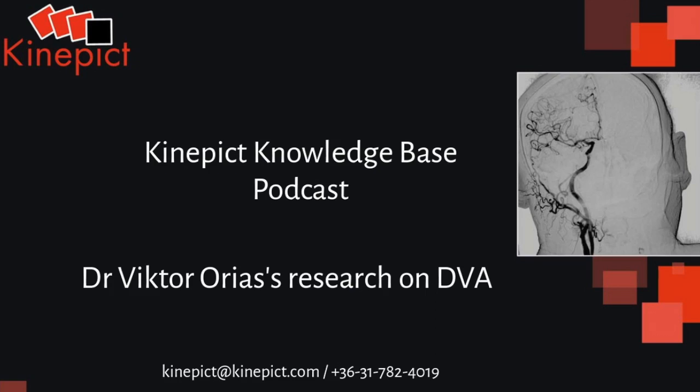So when you started your study on DVA, why did you expect that DVA could help the CO2 users? As previously mentioned, the image processing algorithms of angiography systems are optimized to the usage of iodinated contrast agent. Before the CO2 study, it had been proven that DVA provides better contrast-to-noise ratio when using iodinated contrast medium, and our team hypothesized that taking advantage of this quality reserve may result in significantly better image quality in CO2 angiography. That can potentially be translated into higher diagnostic precision in practice.